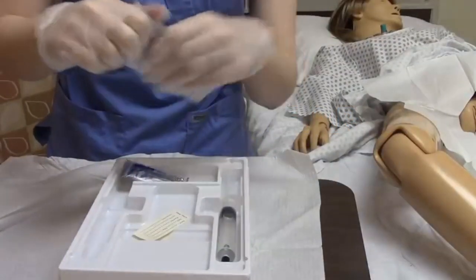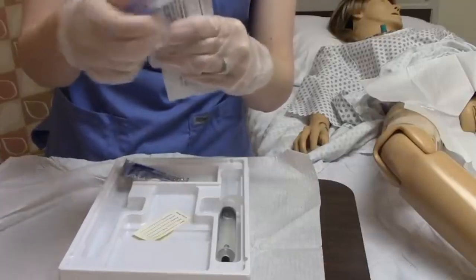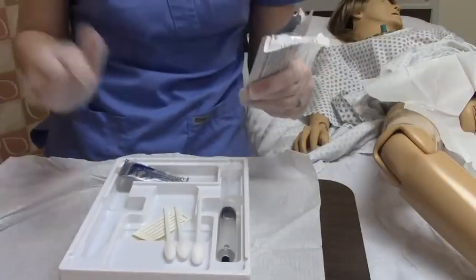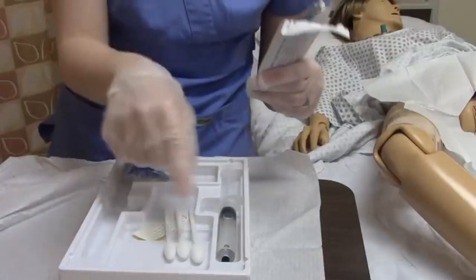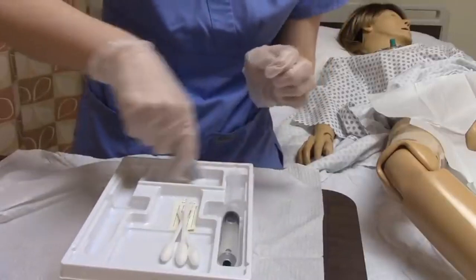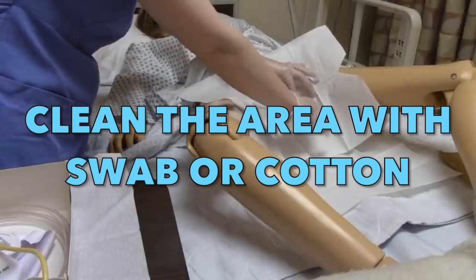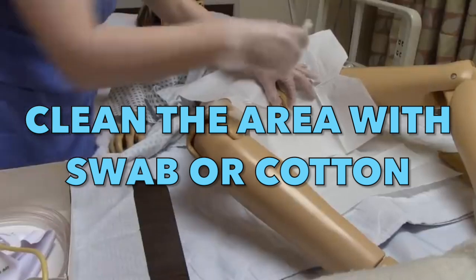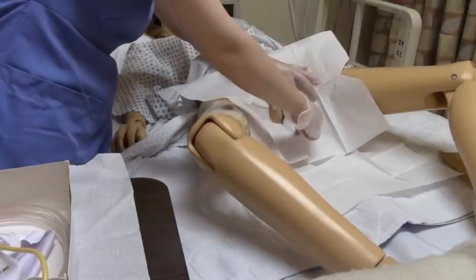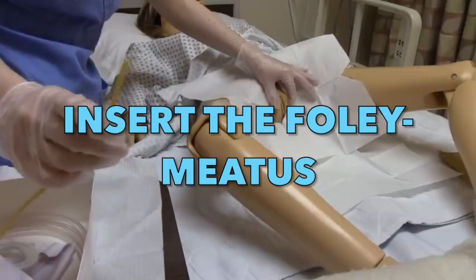We are going to use the applicator — either a betadine-soaked cotton or a chlorhexidine or betadine swab, depending on what is included in your set. Using your non-dominant hand, separate the labia of the female patient; your dominant hand is used for cleaning. Clean the labia using the swab. After the cleaning, we are set to insert the foley catheter into the urinary meatus.